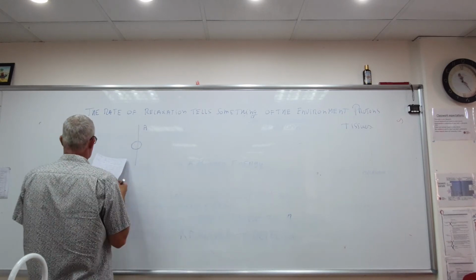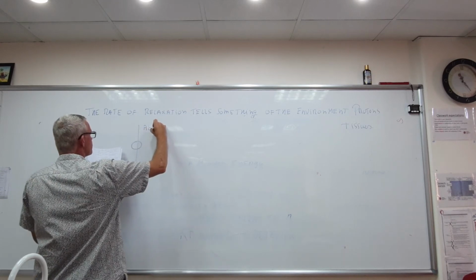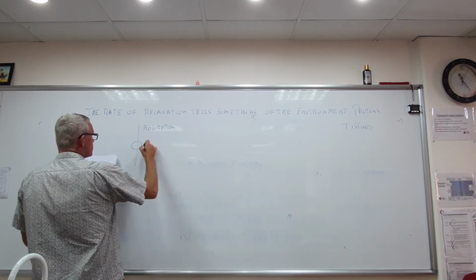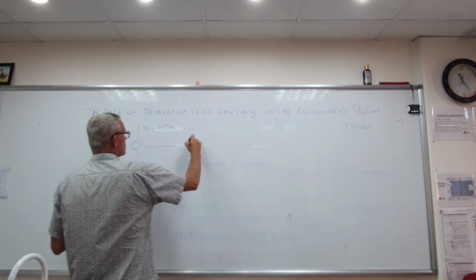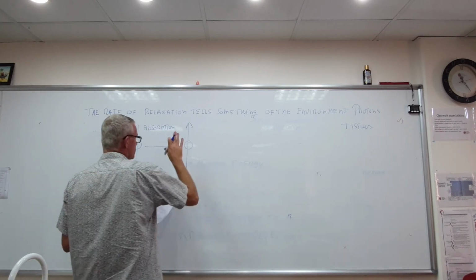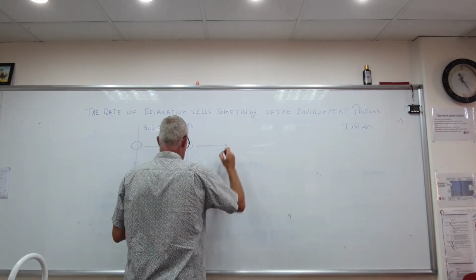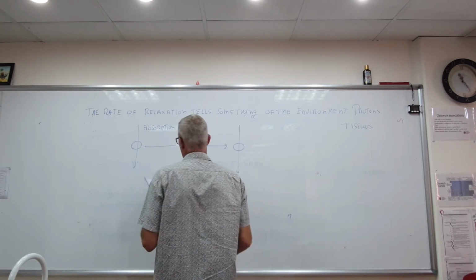So increase energy, so it's going to flip in one way or another, so we get absorption, proton going to flip, then there is no pulse anymore, and then we get relaxation, and the proton is going back to its original state.